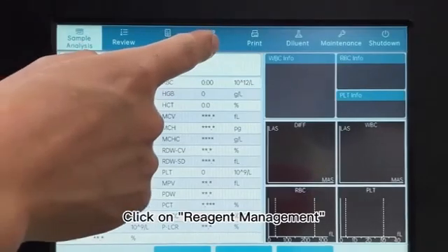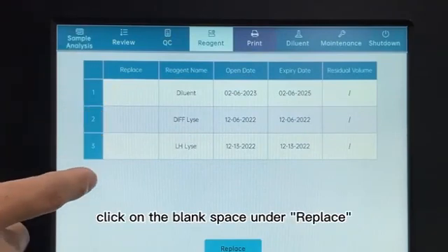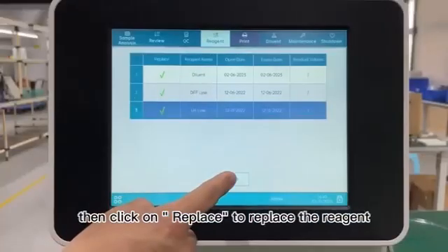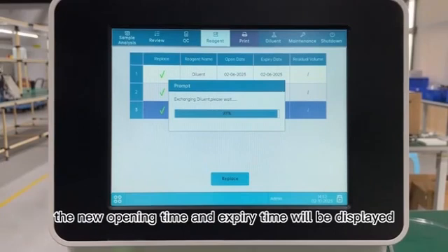18. Click on Reagent Management. The reagent items will appear in the interface. 19. Click on the blank space under Replace, wait until the checkmark is displayed, then click on Replace to replace the reagent. After the reagent is replaced, the new opening time and expiry time will be displayed.